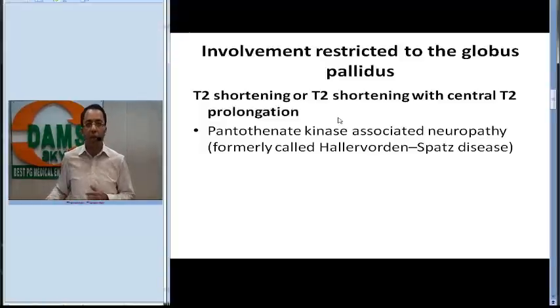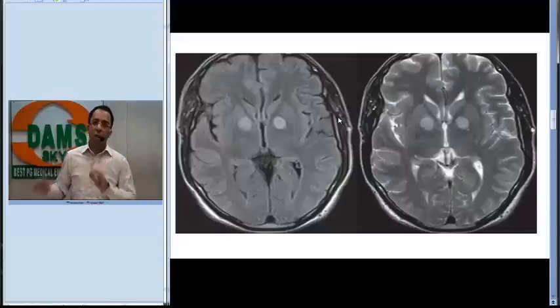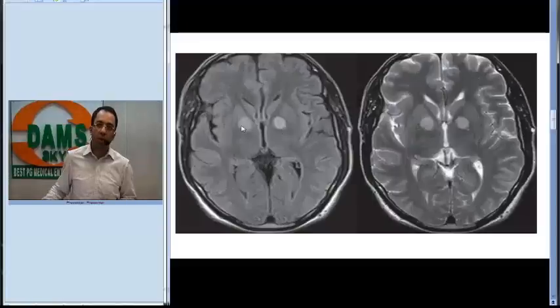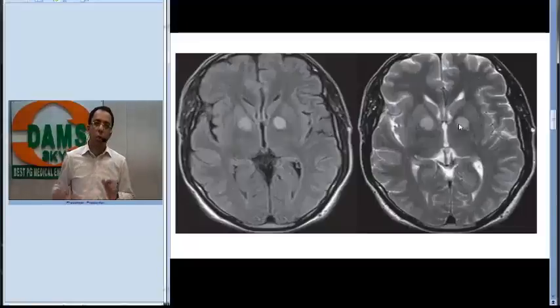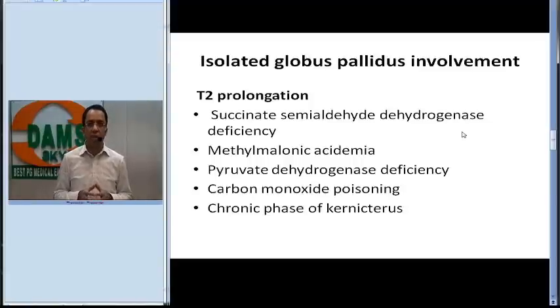This appearance is classically called the 'eye of the tiger' sign. Looking at the next image showing FLAIR and T2-weighted axial images, you can see hyperintense signal in the globus pallidus on both T2-weighted and FLAIR images. Whenever we see such an appearance, the differential diagnosis includes metabolic diseases like succinate semialdehyde dehydrogenase deficiency, methylmalonic acidemia, pyruvate dehydrogenase deficiency, carbon monoxide poisoning, and the chronic phase of kernicterus.